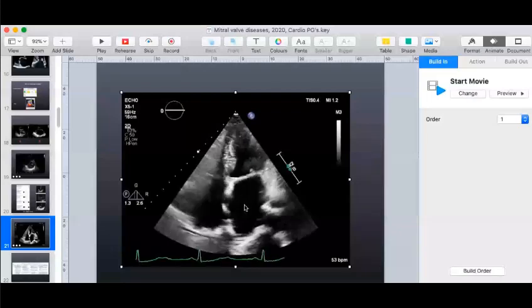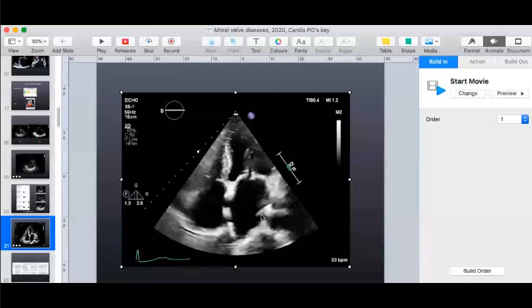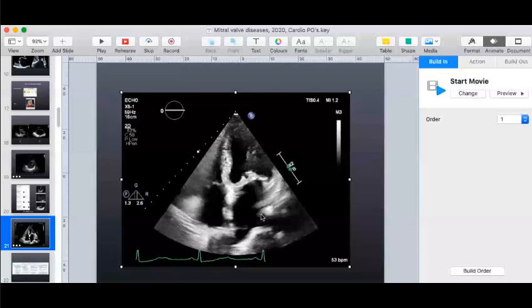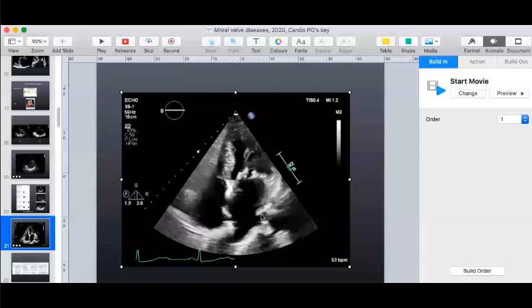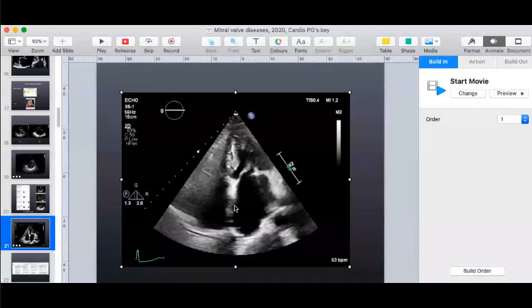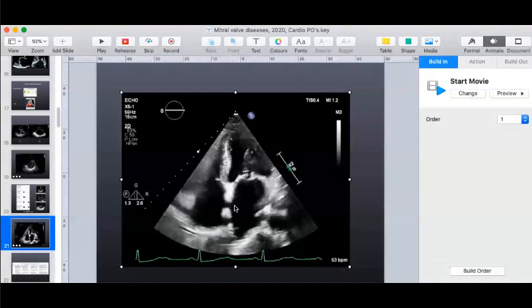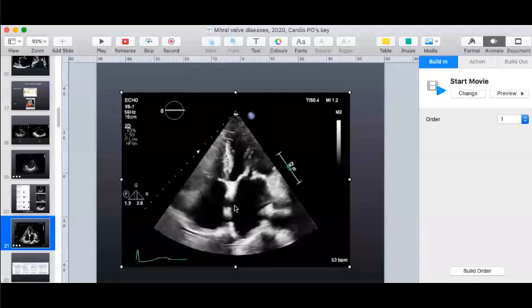Underfilled, small LV. That is the one. And there is one very subtle finding, which, if you have really sharp eyes, can you tell me some other finding which is also important? Septal discontinuity. PFO. Okay, until and unless I put a color on it, I will not be able to confirm it. Post-PBMV status, sir. Septal discontinuity is there. Okay, maybe.